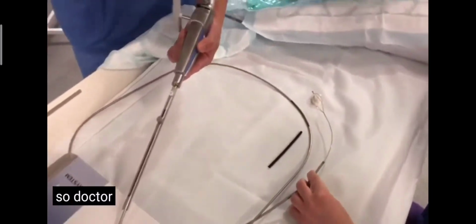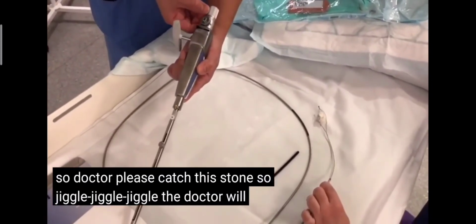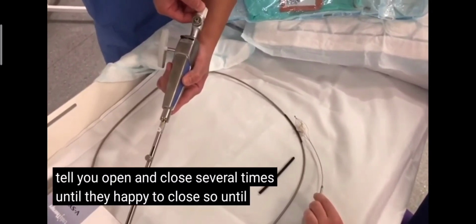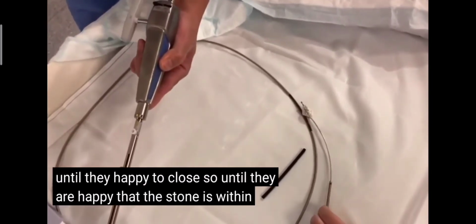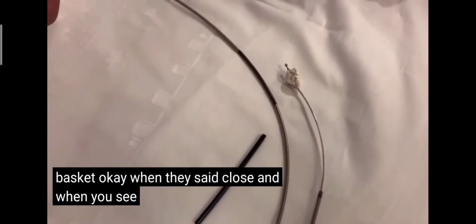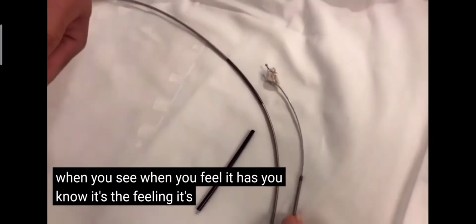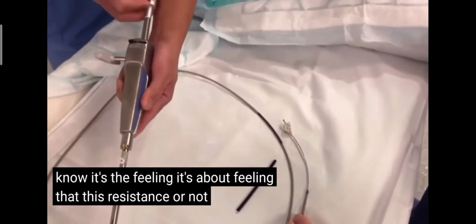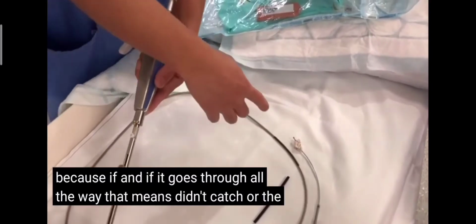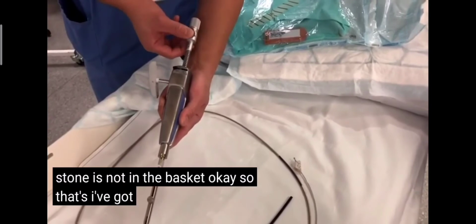So doctor, please catch the stone. Jiggle, jiggle, jiggle. The doctor will tell you to open and close several times until they are happy that the stone is within the basket. When they say close, it's about feeling whether there's resistance or not. Because if it goes through all the way, that means you didn't catch it, or the stone is not in the basket. Okay, so I've got resistance in here.